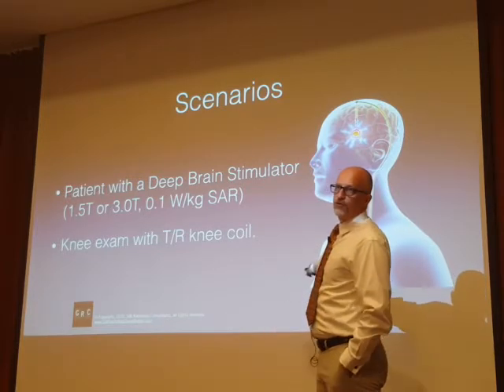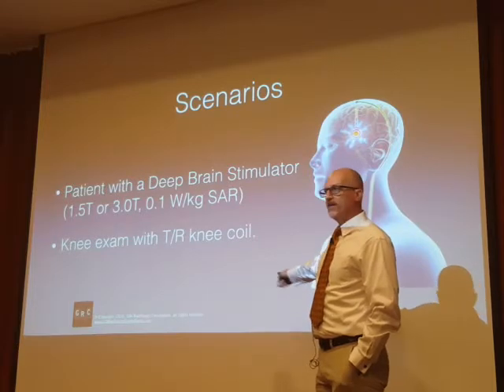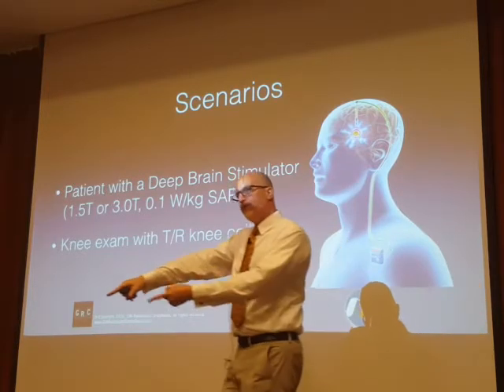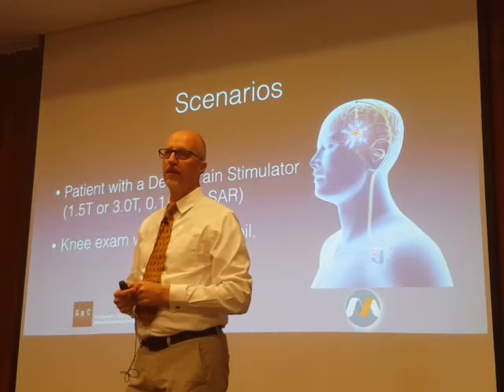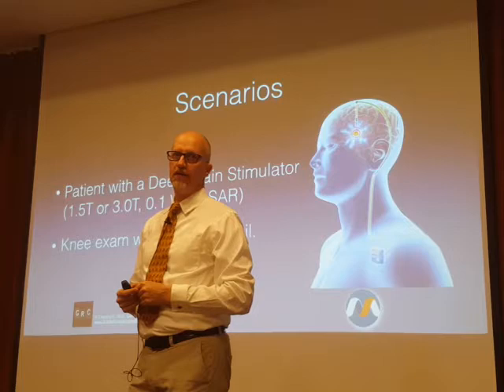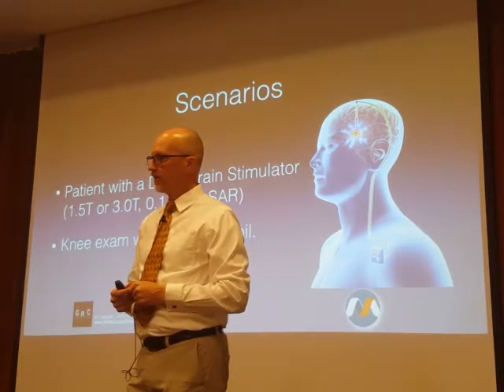Is the exposure to the static magnetic field going to be different if we put this patient in feet first rather than head first? Feet first, for the knee.